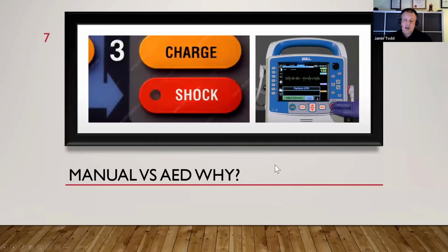So how have we ended up where we are, with manual defibrillation versus AED, and why? As times have changed, the Resuscitation Council now dictates that there should be no more than a 10-second maximum gap in chest compressions to allow us to do rhythm recognition and anything else we want to do. But certainly in practice and in the education that I lead on this, we really try and stick to 5 seconds maximum in a well-organized team. That's perfectly achievable.